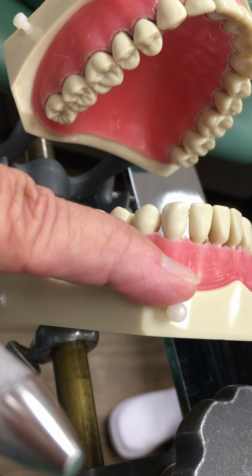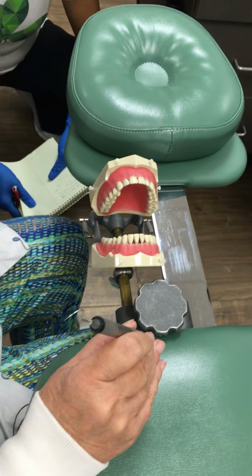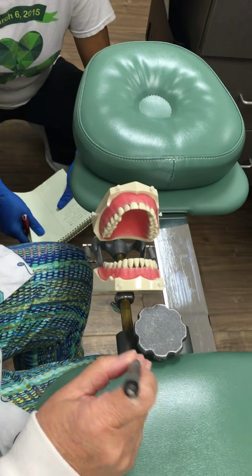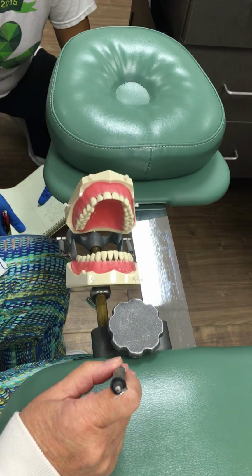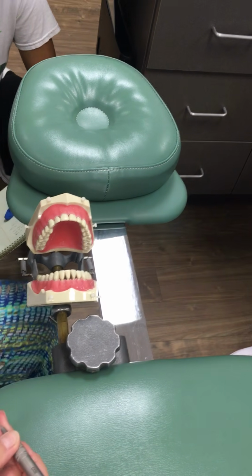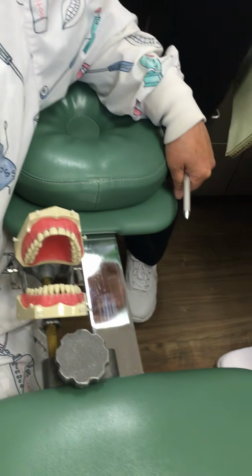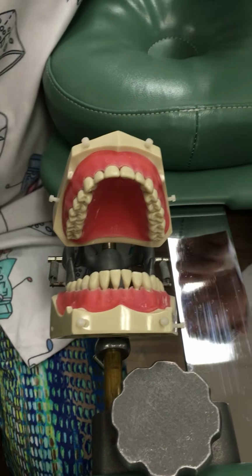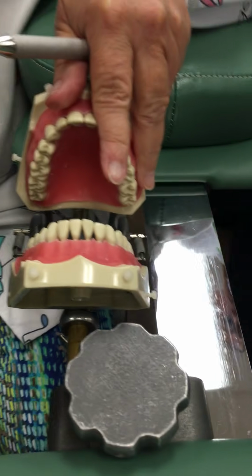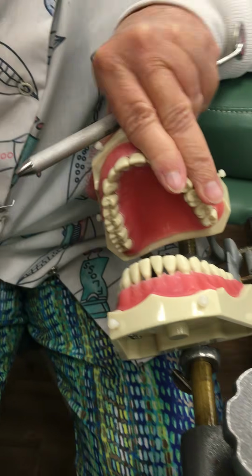Everybody see that? Okay, so that was the toward surfaces in the anterior. And we only have done half of each of those teeth, correct? So we have to do the other half. To do the other half, we're going to move to the away direction, which is going to be up here somewhere between 9 and 11:30. Turn our mannequin towards us.